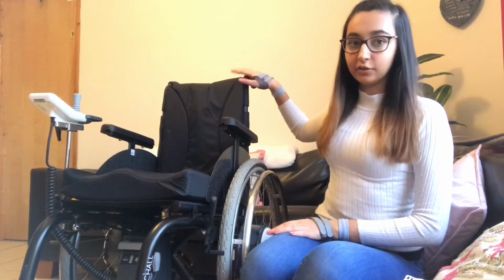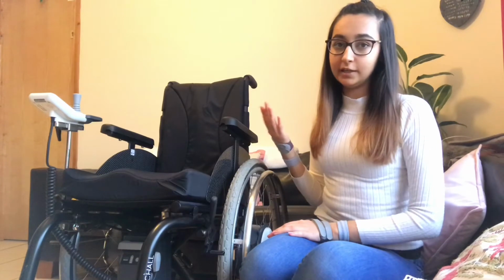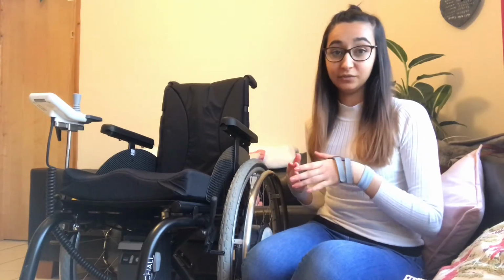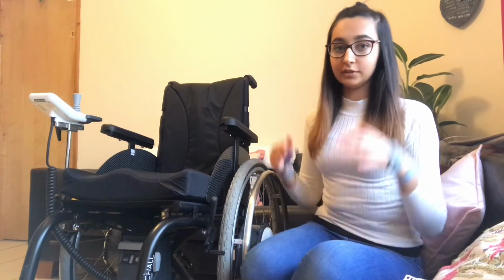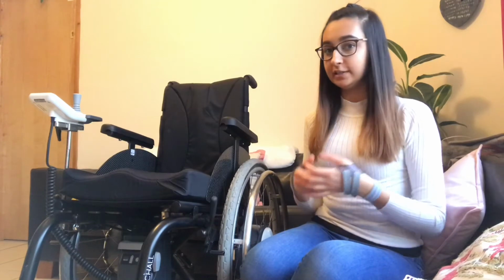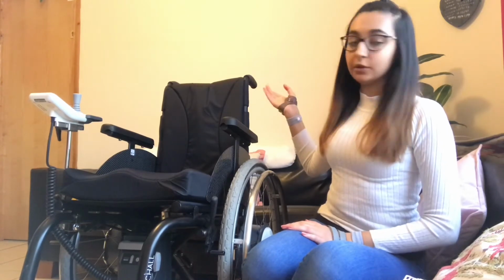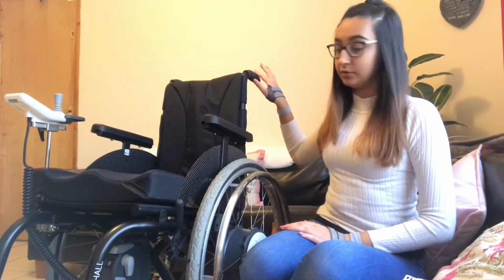The backrest I've got quite a bit higher, and the reason for that is that I'm not really an active wheelchair user. I am in the sense that I use it a lot, but I'm not because I can't wheel myself, hence the adaptations on this one. And so for me it wasn't necessary to have a low back because I needed the support more than I needed to be able to wheel myself. So as well as the higher back, I've also got handles that don't push down. For me it was just because they were cheaper, and I found that I didn't really use the push down handles on the old chair.